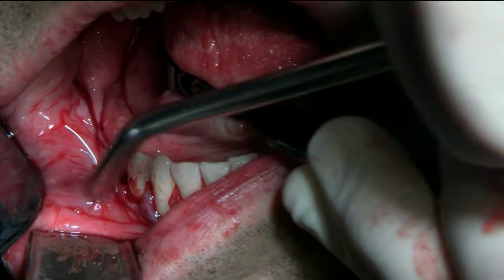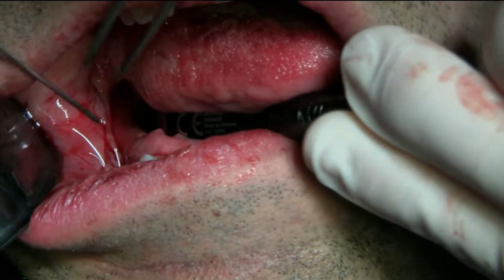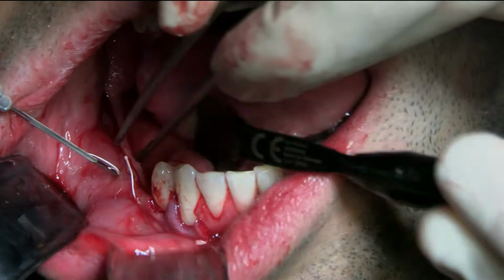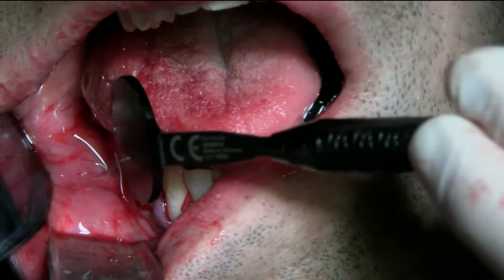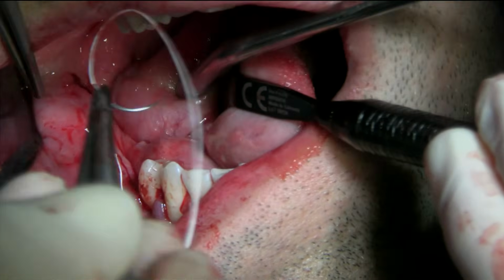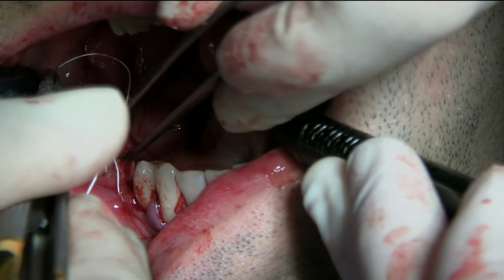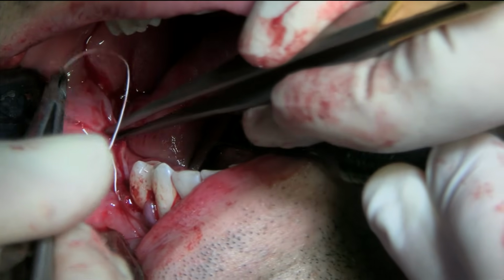And I would say the answer is no. It's probably the contrary, because the collagen is a natural collagen membrane, so it's very, very tissue friendly. Remember, the goal of that collagen was mainly to keep the bone in place, because we had a couple of areas where the PTFE did not cover the bone graft, so this will be about 2 months of security, but it will not compromise the blood supply.